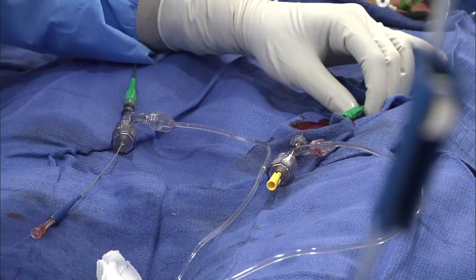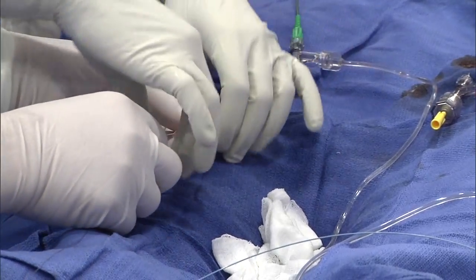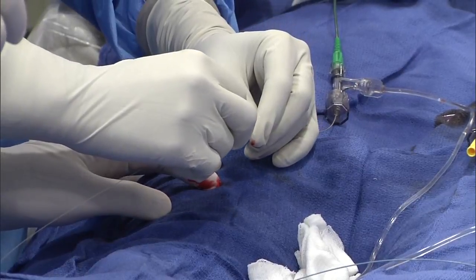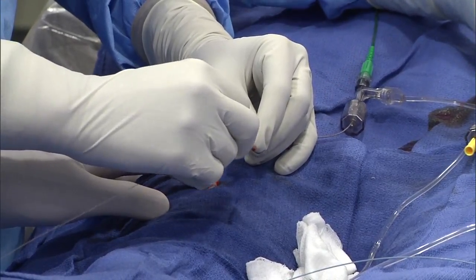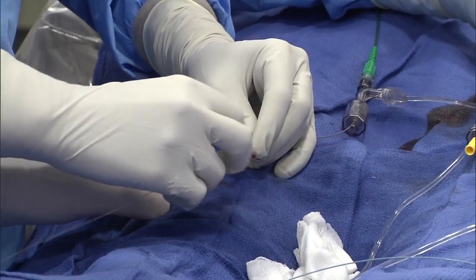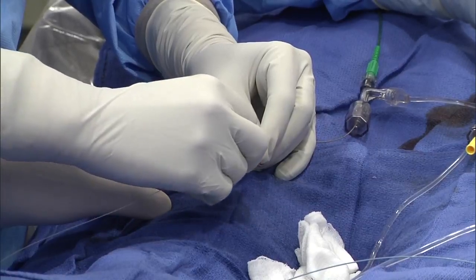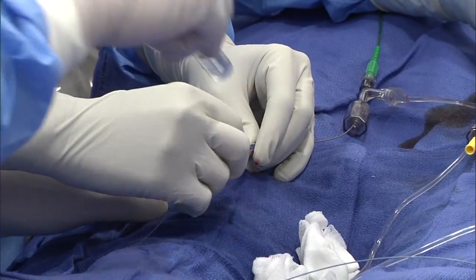Holding it. Somebody has to be advancing. It's tough. Keep going. Okay, good. You want to see it from the coronary point of view first? That's okay. Hold it up. We disconnected a little too early. Yeah, you are the one pushing it.